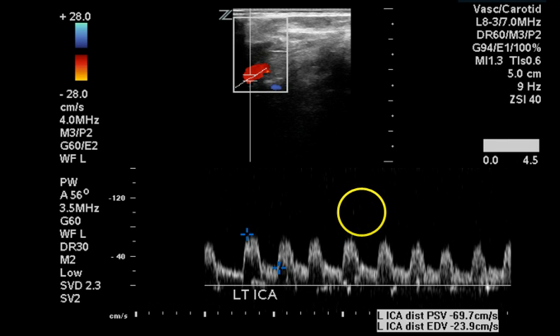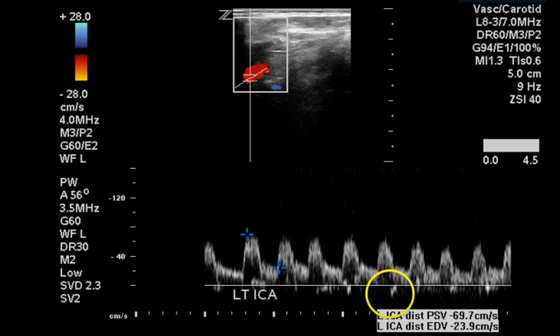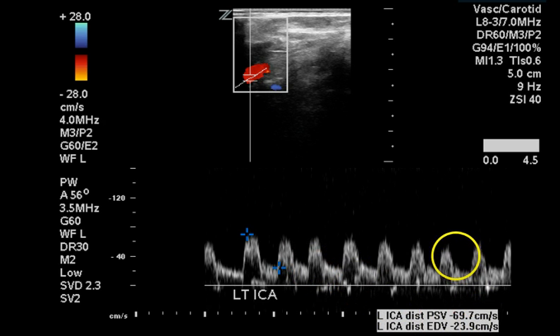The distal ICA again has a normal waveform, a good spectral window is visualized, and normal velocities are present.